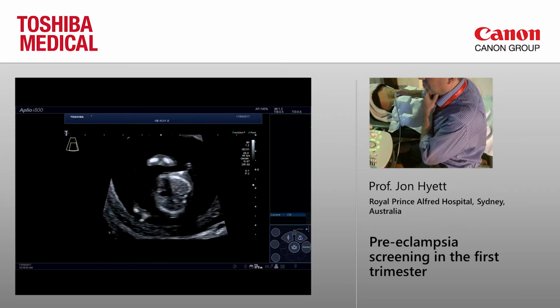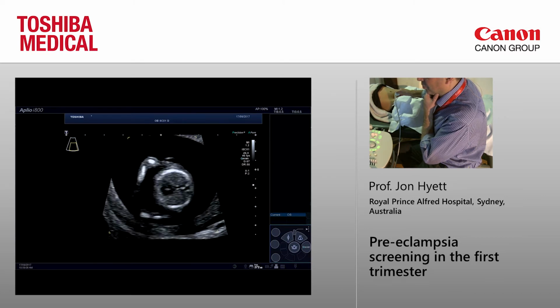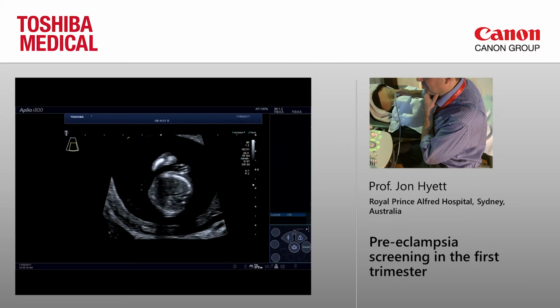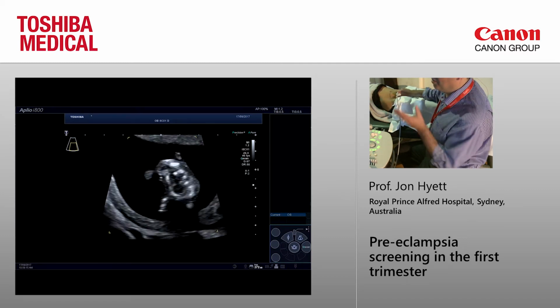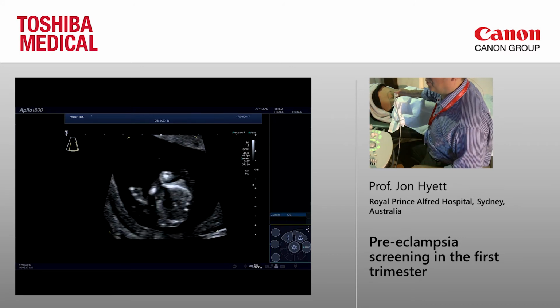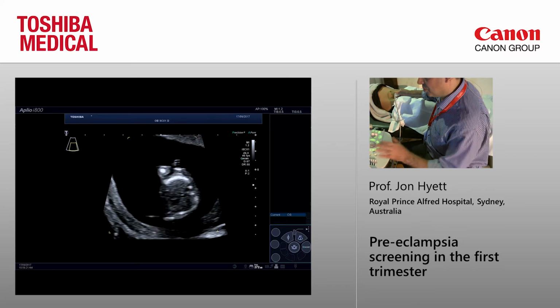So I'm a bit of an opportunist when I'm scanning in the first trimester, and you know, if you've got the fetus in a nice position to be able to look at various structures, it's good to do that. You can also see the baby's moving quite a lot. So often I find it's better just to sit in one place and let the fetus do the work.